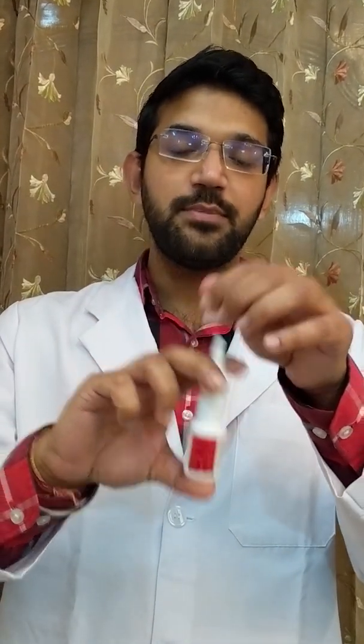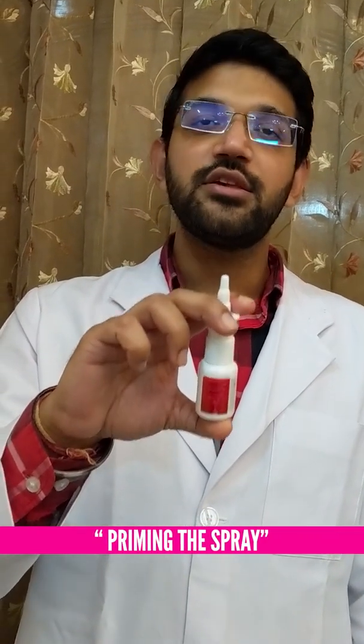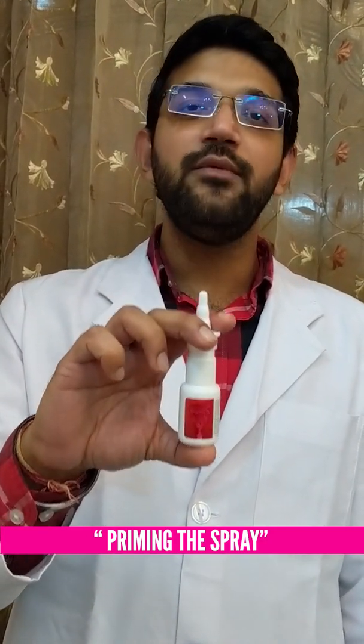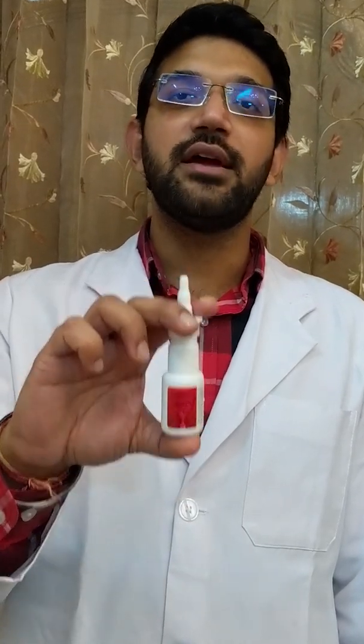After that, we remove the plastic cap and spray the nasal spray in the air. This is known as priming. The medicine should come out in the form of a mist. This priming is required when we are using the spray for the first time or if we are using it after a gap of few days.